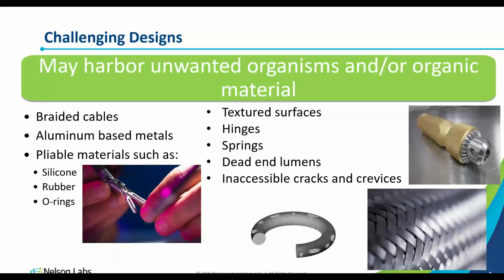So in terms of validation testing, there's currently not a requirement out there. So there's no dry time validation for after the cleaning process to ensure that it's dry before the sterilization process. However, the device does need to be dry.